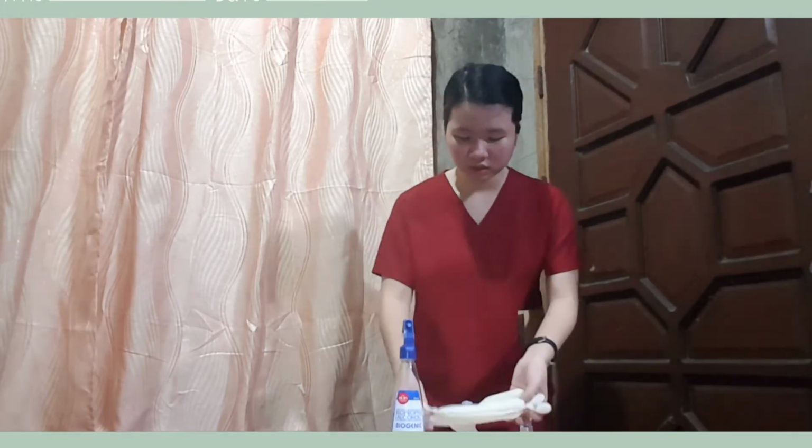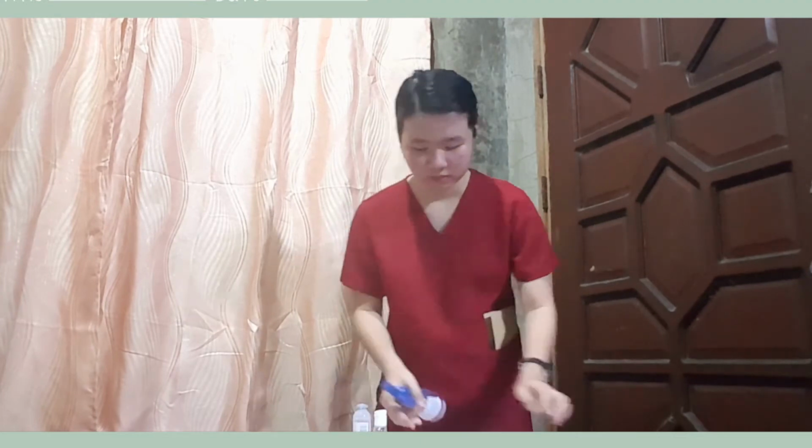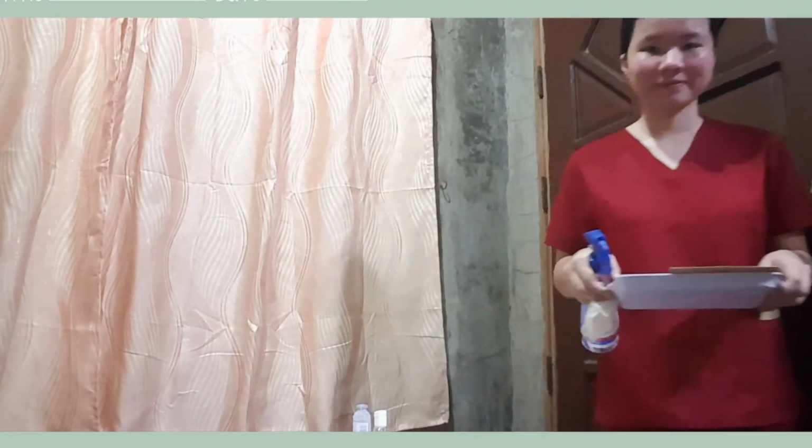And now we're going to proceed to the giving of subcutaneous injections. For procedure number 16, we need to transport the medication tray with the alcohol prep to the patient's room. This saves time and uses our energy efficiently. So now we're going to do it. I'm going to set this aside. Let's go.